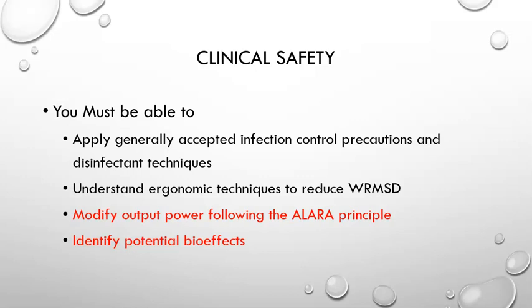You need to understand how to modify power output and follow the ALARA principle. ALARA means as low as reasonably achievable. You need to be able to identify potential bioeffects. Are you going to be causing bioeffects in your patients? I sure hope not. How are you going to know that you're not? Well, we'll talk about that when we get to it.